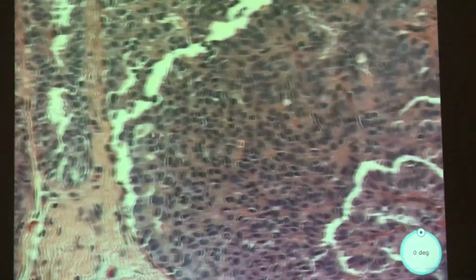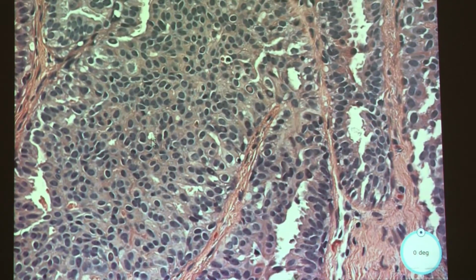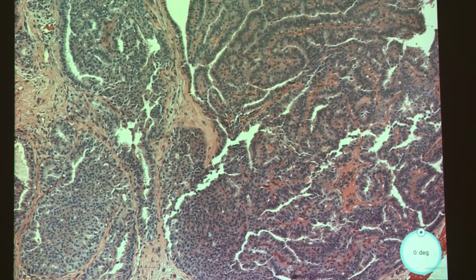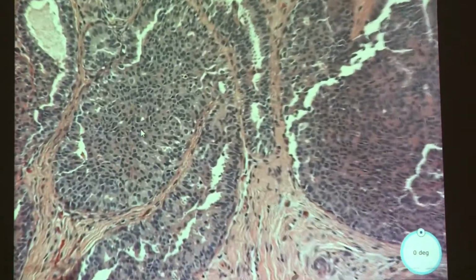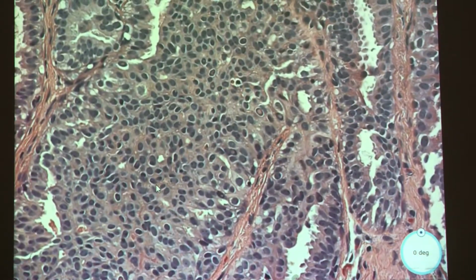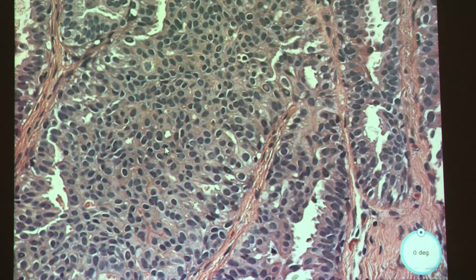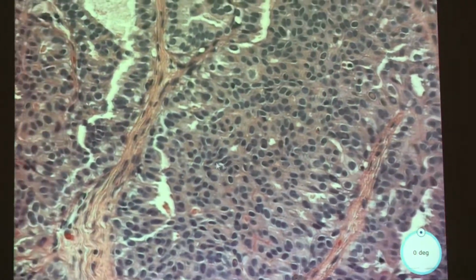interesting because it looks kind of more... I want to say it looks a little more different than this area, let's say. It's a little more solid. And the cells, well, other than these, that kind of reminds me of epithelial cells in a UDH, for instance. That's great because those are actually cells that you can see in different lesions that mimic myoepithelial cells. But that's okay.